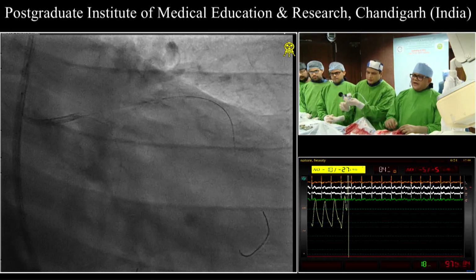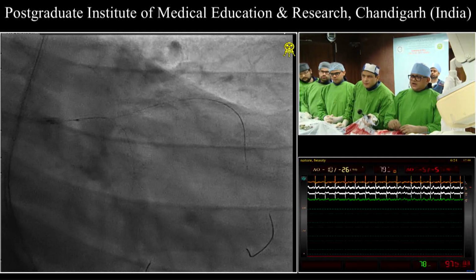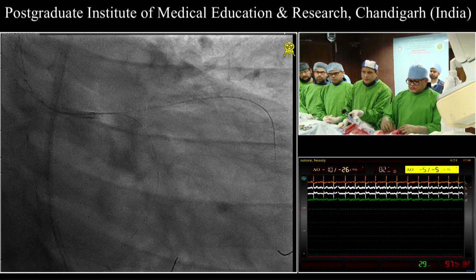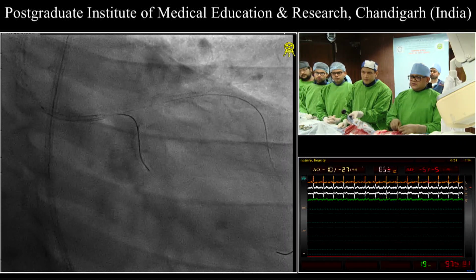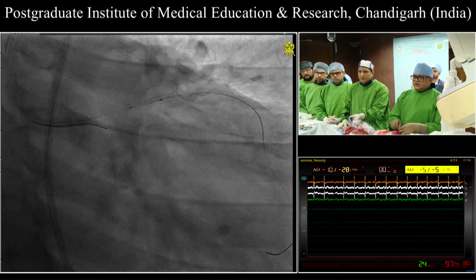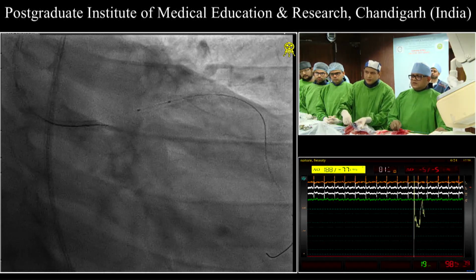So okay, we have dilated with a 3 millimeter non-compliant balloon, and still I do have some difficulty in crossing the cutting balloon across. Let me see. Yeah, so I could cross it.